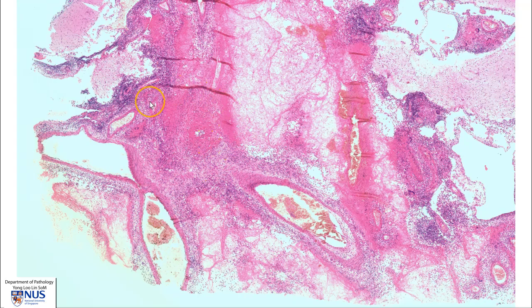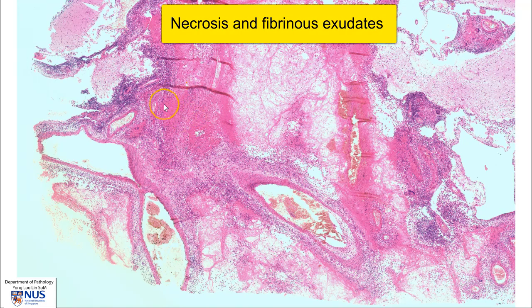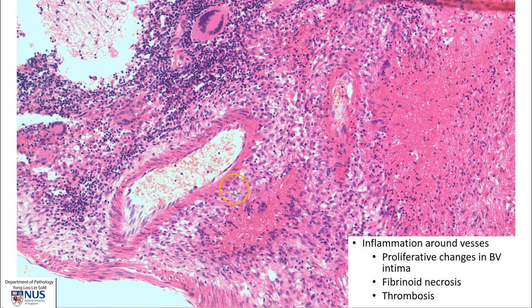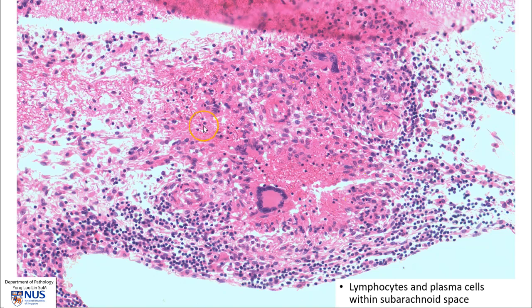Here is a higher magnification view. We can see over here an area of necrosis within a large granuloma. Often, the inflammation will be very closely associated with the leptomeningeal vessels. Here we can see a blood vessel, and there is a necrotizing granuloma comprising these epithelioid histiocytes and areas of necrosis. This can also give rise to proliferative changes in the blood vessel intima, fibrinoid necrosis, and thrombosis. Here is another necrotizing granuloma with a Langhans giant cell, and also accompanying lymphocytes and plasma cells.